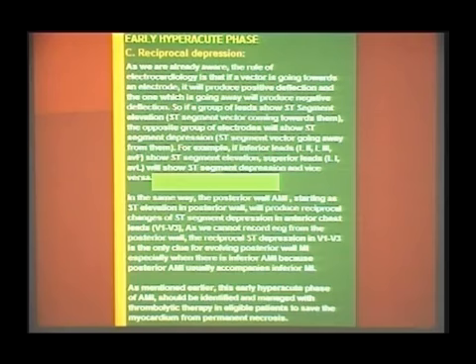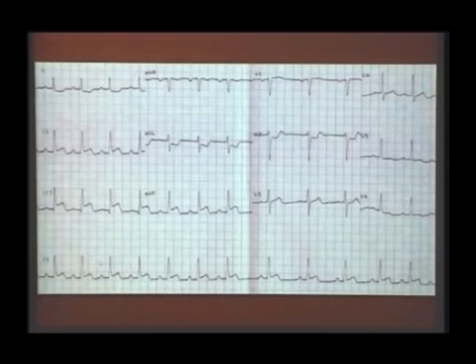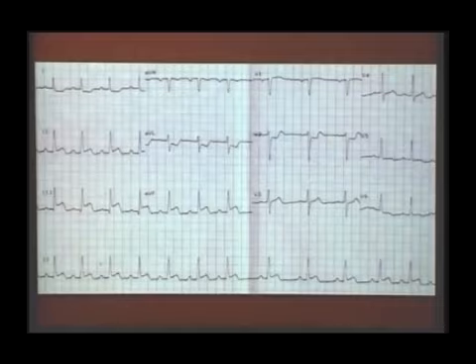So when the ST elevation is happening through a certain group of leads, the ST vector is coming towards that group of leads. For example, in this ECG, the ST elevation is there in inferior leads, meaning the ST vector is coming towards inferior leads. That's why ST elevation is there. When it is coming towards inferior leads, it is going away from which leads? What is the opposite of inferior leads? L1, AVL, your superior leads are L1, AVL.